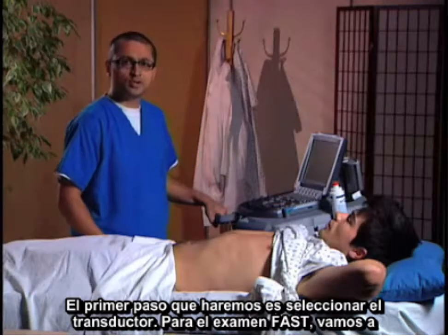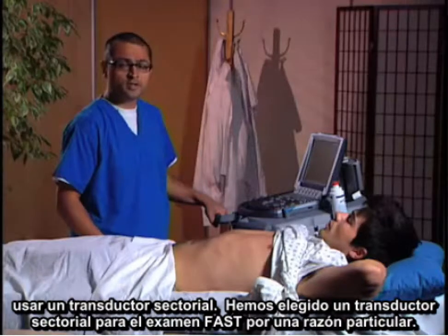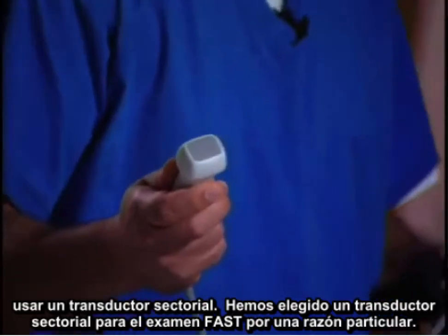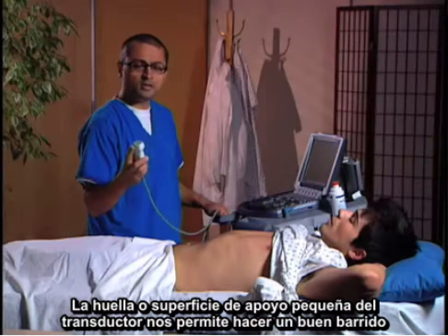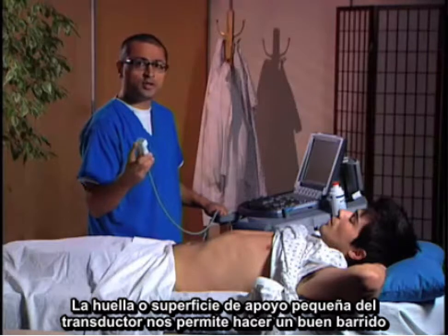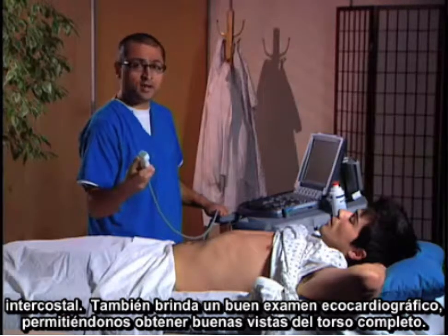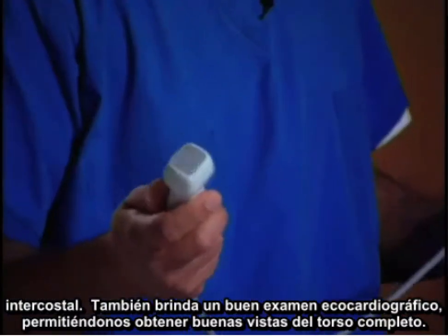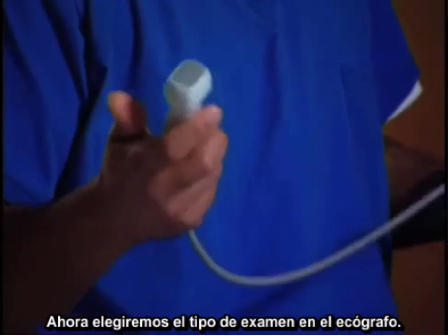First, you're going to choose your transducer. For the FAST exam, you're going to want to use a phased array transducer. We've chosen it for a particular reason: the small, tiny footprint of the transducer allows us to do great intercostal scanning. It also provides great echocardiographic examinations, allowing us to get good views of the full torso.